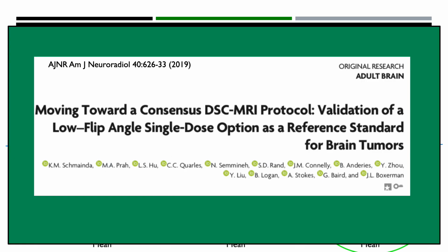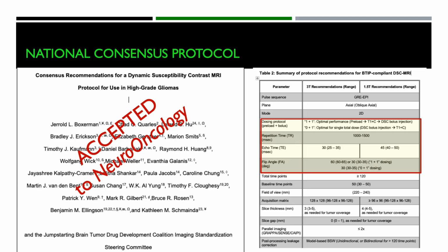This was written up as a paper entitled Moving Towards the Consensus DSC-MRI Protocol. And this was the foundation for the final national consensus protocol that has just been accepted for publication in the journal Neuro-Oncology.